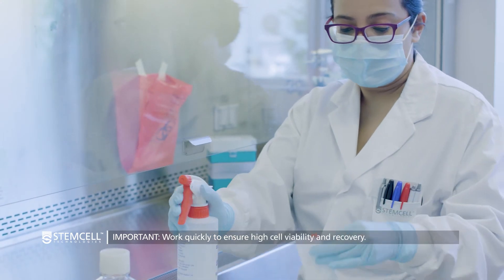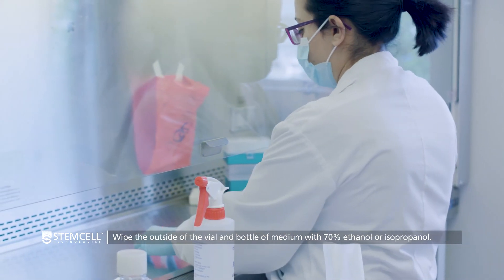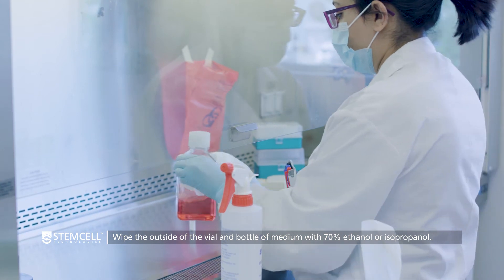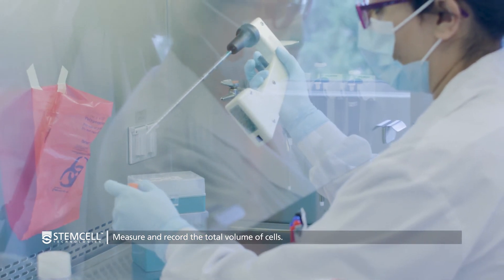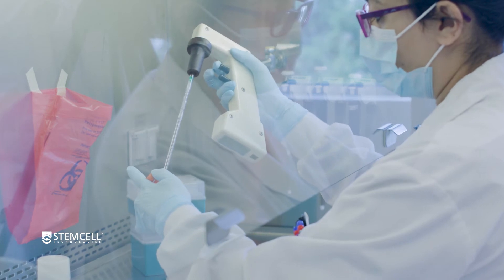It is important to work quickly in the following steps to ensure high cell viability and recovery. Wipe the outside of the vial again with 70% ethanol or isopropanol. Measure the total volume of the cell suspension using a 2 milliliter serological pipette. This value is used later to calculate the number of cells provided.